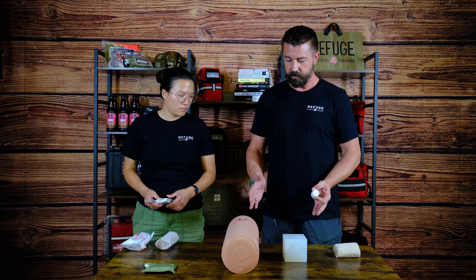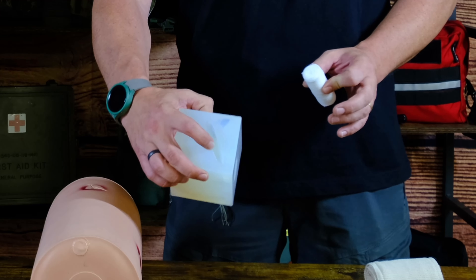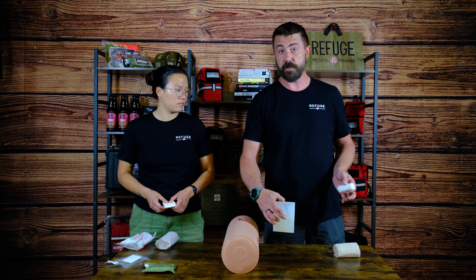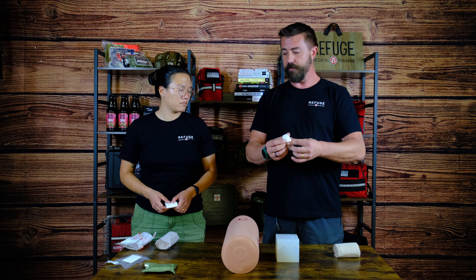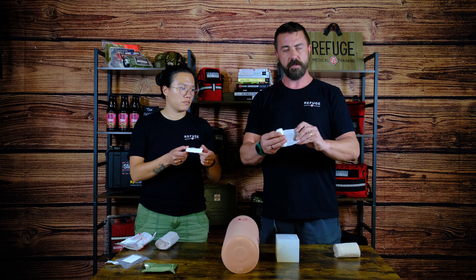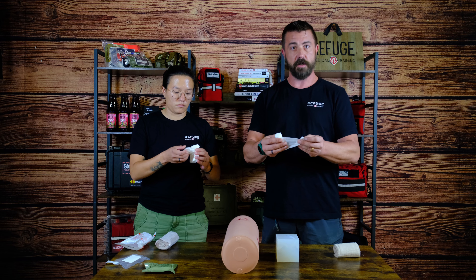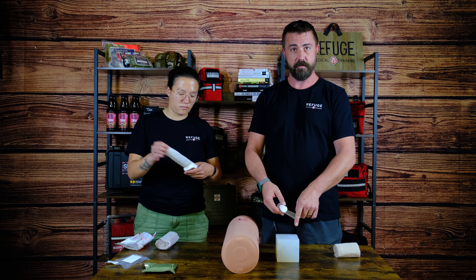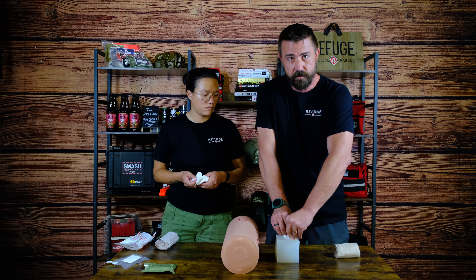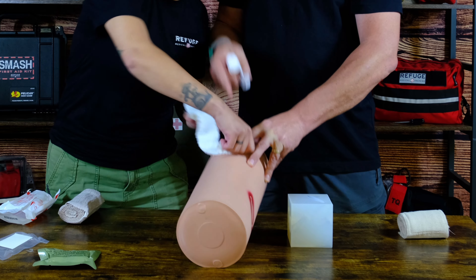When we're talking about wound packing, there are two different kinds basically. There could be a huge gouge, something like this that you see in this wound cube, where there's a chunk taken out of the flesh — this could be from a chainsaw or something like that. There are a lot of different types of gauze. This is compressed gauze, which is six-ply, and then this is much cheaper gauze you can find at a Walmart. This type of gauze is equally as useful, especially if you're dealing with a wound of this nature. You may just take this whole roll and pack it in there completely, or if you're dealing with a small entry, it's easier to pack this in than the thick gauze.